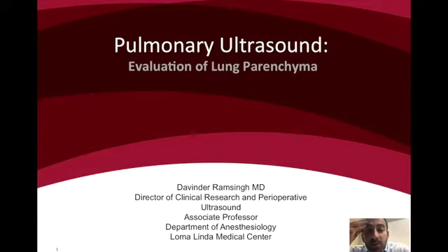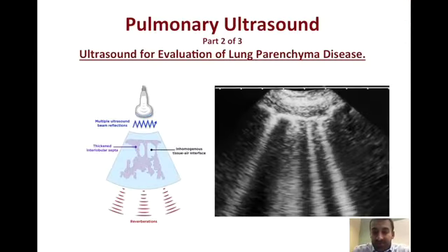Hello, this module will evaluate the utility of pulmonary ultrasound with a particular focus on how point-of-care ultrasound can be useful to look at the lung parenchyma. Fundamentally, the idea of using ultrasound to identify the lung parenchyma has often, up until recently, been thought a misnomer, because the interface of the lung tissue causes too much ultrasound reflection and therefore prevents penetration into the lung tissue.